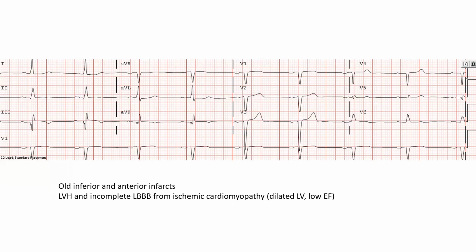But the increase in myocardial mass does not mean concentric LVH. It could be an increase in myocardial mass from eccentric LVH that you get in a dilated myocardium, as in ischemic cardiomyopathy or dilated idiopathic cardiomyopathy. Another idea is that LVH doesn't just reflect myocardial mass, it also reflects LV size, cavity size, LV dilatation. That can give you LVH as well.